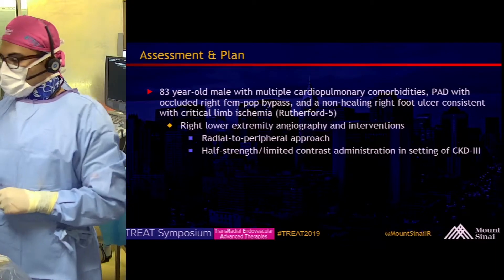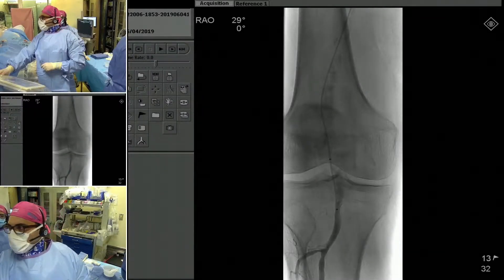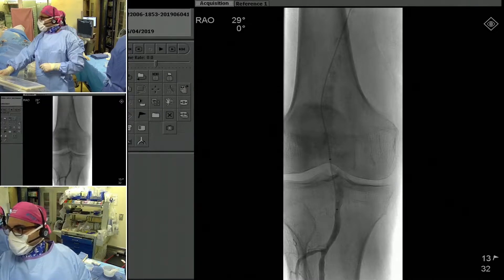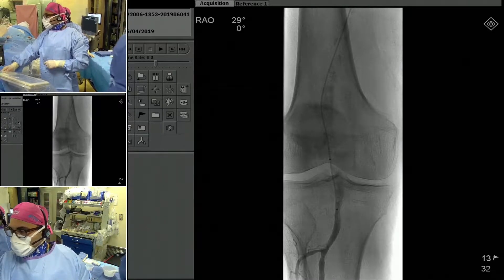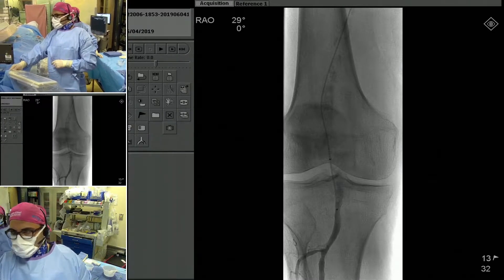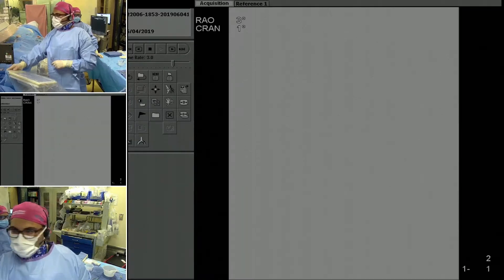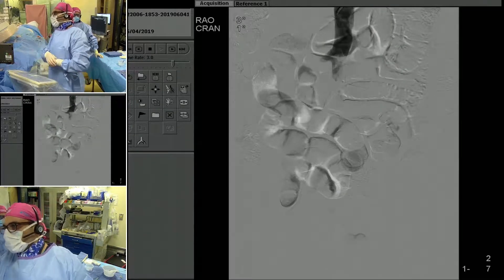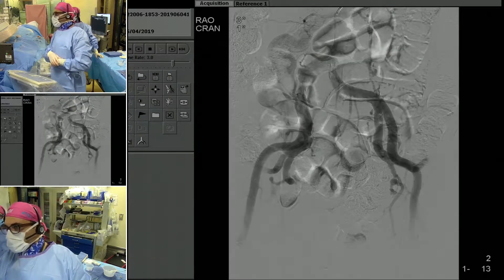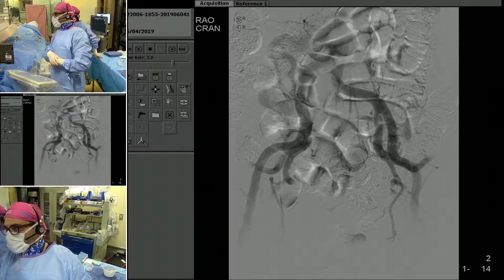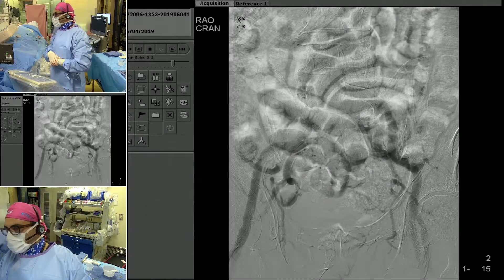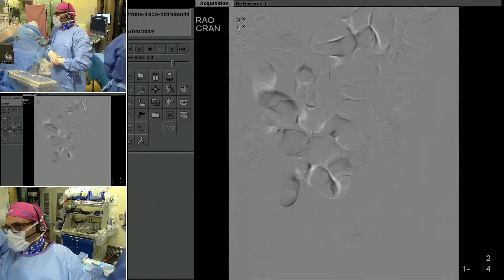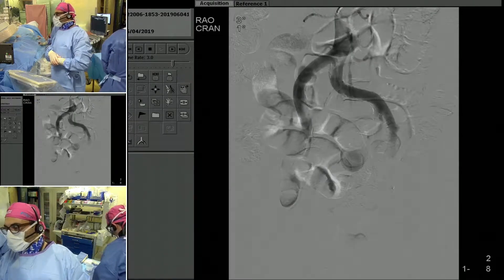Let's go through the imaging. As Dr. Sattano mentioned, we have a patient here with CLI and reduced ABI. As you would expect with CLI patients, he has multilevel disease. We have treated these cases successfully transradially — multilevel — including the SFA popliteal and even down through the tibials.